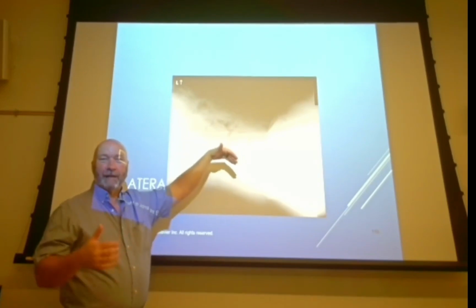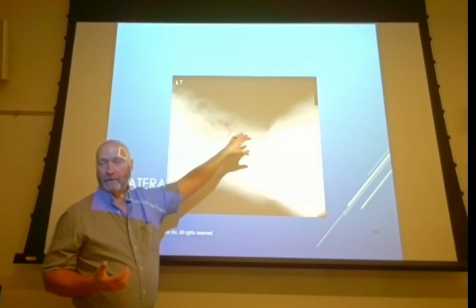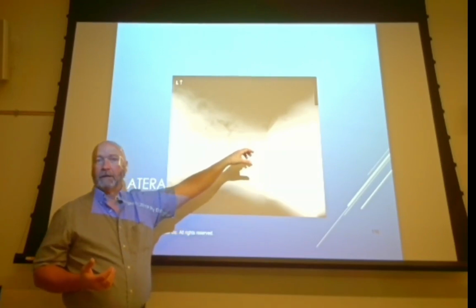So with it being directly over the vertebra, when you shoot your AP, you just don't see it all that well. But if you see something on the AP that just doesn't look right, and you shoot a dorsal decubitus and you see anterior to the vertebra, you see this calcification in what looks like a tube. Only so many tubes that are going to be directly in front of the vertebra. That's going to be, most commonly, if it's got calcium in it, your aorta.